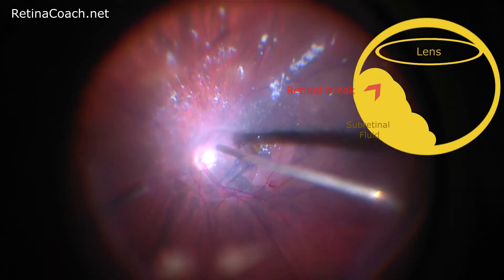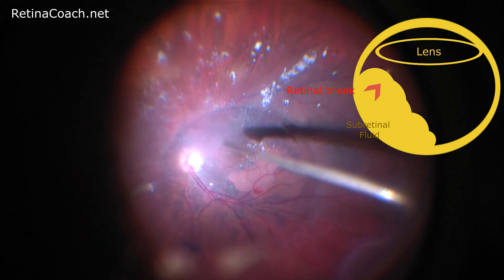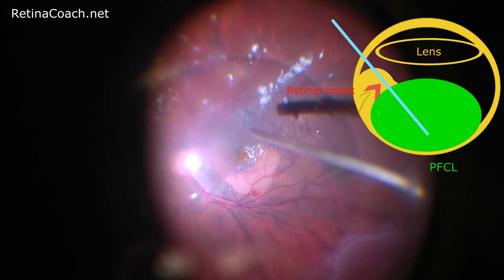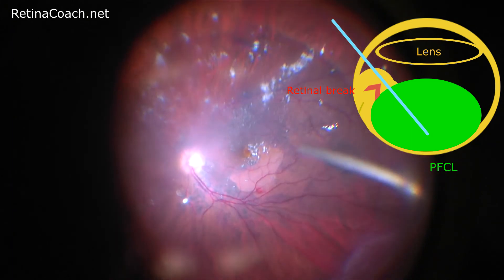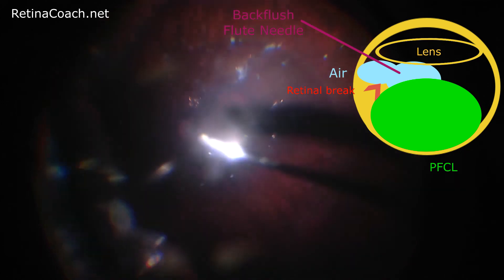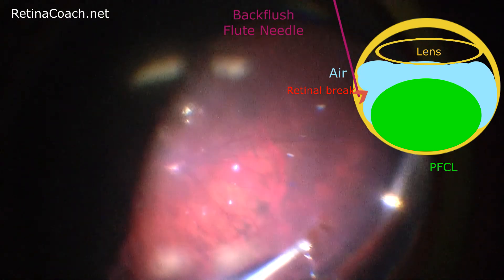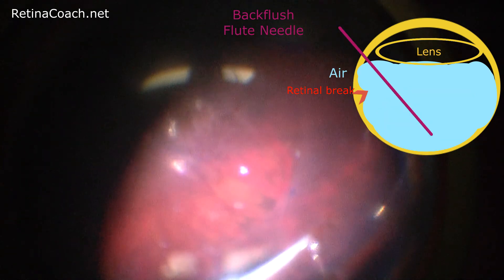The second technique to re-attach the retina is called the sandwich technique. In this case, the eye is filled with perfluorocarbon to the most posterior retinal break border, as shown in this video. Perfluorocarbon liquid facilitates shifting of subretinal fluid from the posterior pole towards the retinal break. Then fluid-air exchange is performed while draining the subretinal fluid from the break. Once the retina is completely re-attached, perfluorocarbon liquid is removed and endo laser is performed under air.